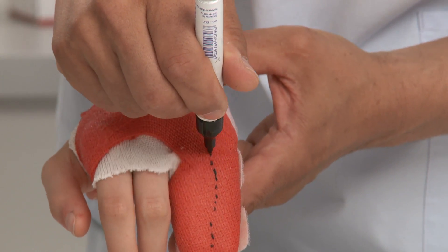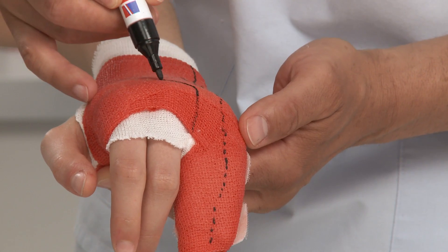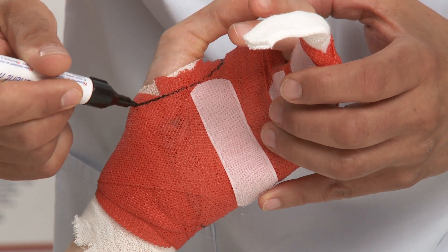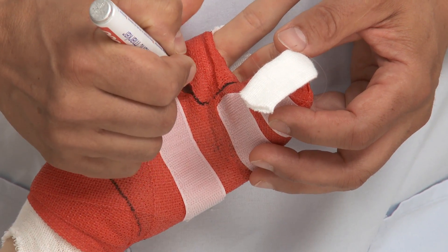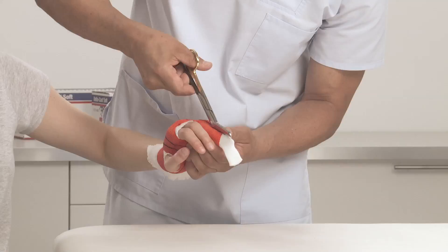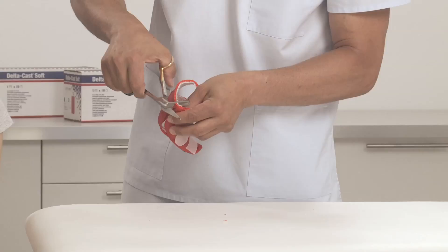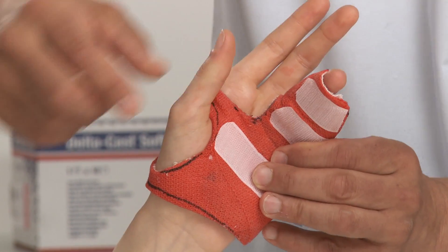Use a marker to draw the desired cut lines on the cast. Cut along the main cut line and remove the cast. Trim the borders of the cast for a good fit. Place the boxer cast on the patient and conduct fit tests for patient comfort to see if more trimming is required, and check for the allowed motion.